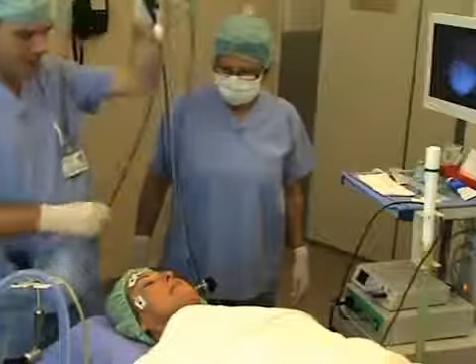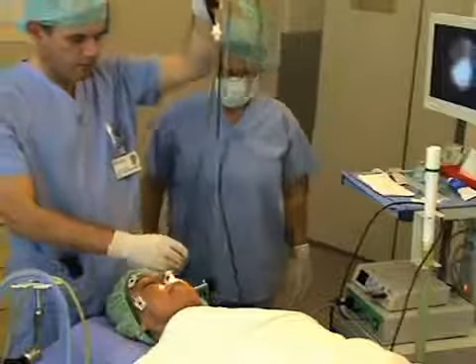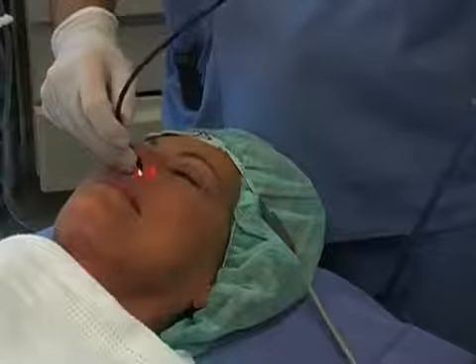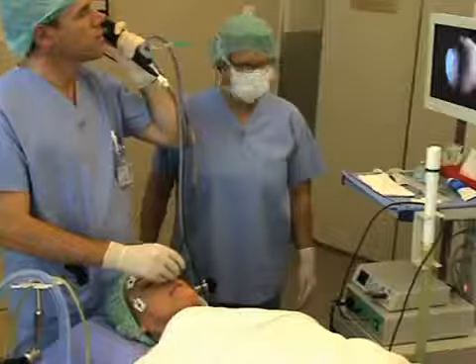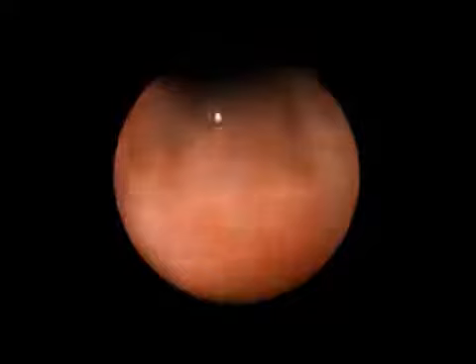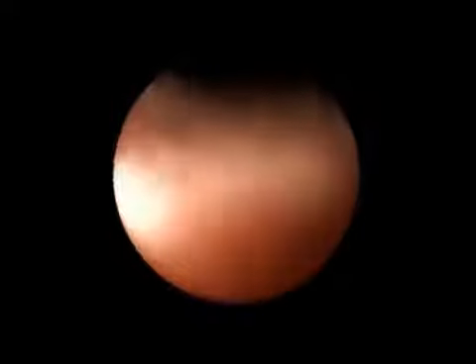Stand above the patient's head and explain each step as you proceed. Hold the fibroscope near its tip in order to get the best feel for the instrument as it proceeds through the lower nasal passage. Direct the fibroscope parallel to the patient's nasal floor. By constantly keeping the floor of the nasal cavity in view, you will prevent upward movements of the fibroscope, which directs it towards a blind recess.